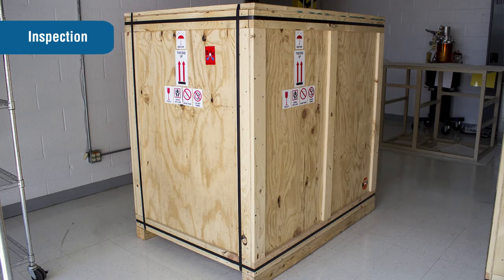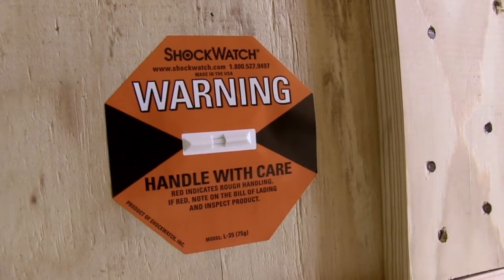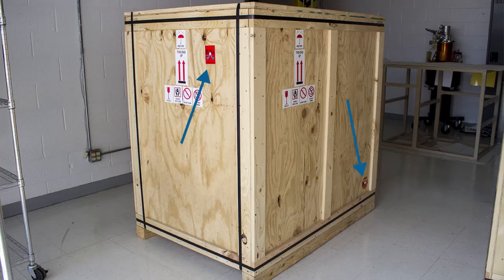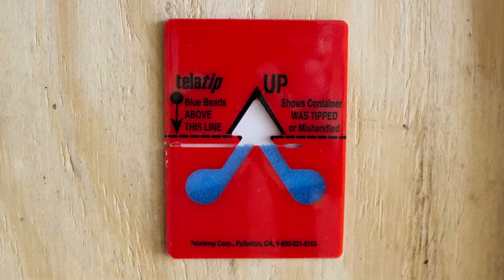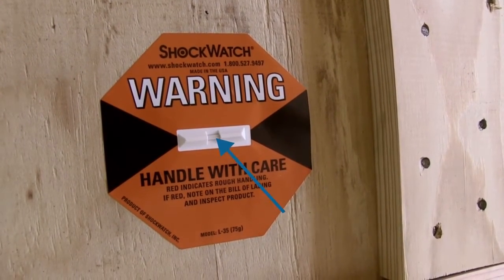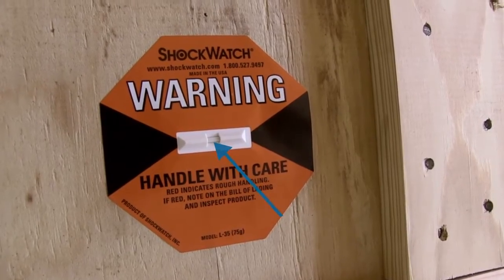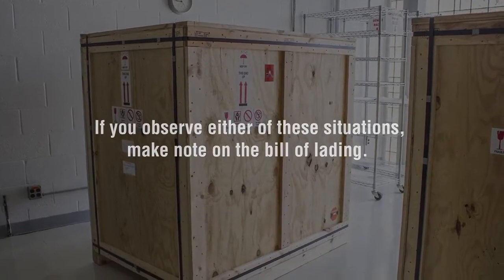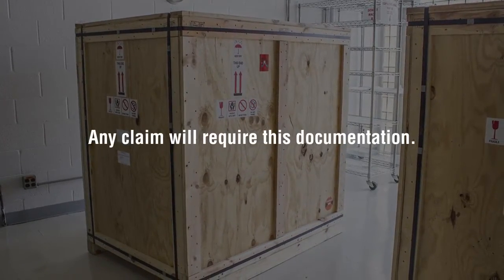The OGL is secured in a wooden shipping crate that is equipped with two shock impact and two tilt-tip indicators. Upon receipt, inspect these four indicators. If the tilt-tip indicator arrow is blue, it means the system has been on its side or tipped over in transit. If the shock impact indicator is red, the system has been subjected to rough handling. If you observe either of these situations, make note on the bill of lading. Any claim will require this documentation.